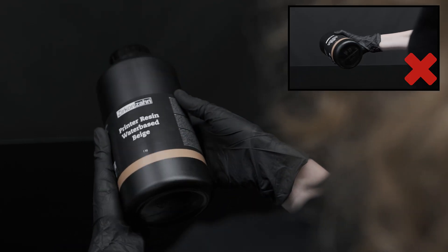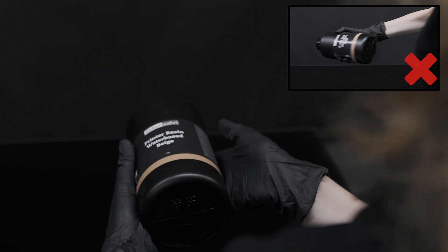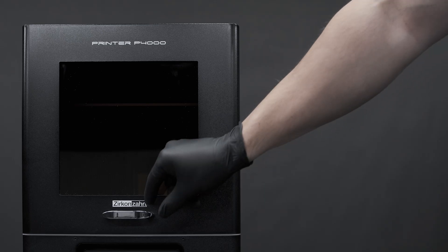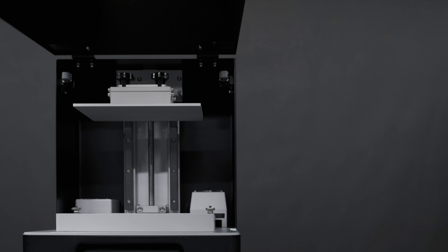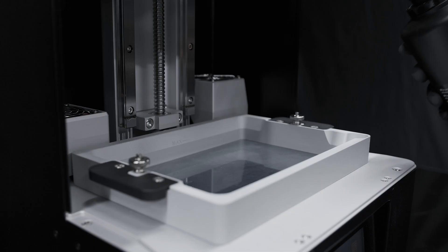Shape gently the resin bottle for about 30 seconds to make sure pigments are mixed homogeneously and to avoid air bubbles. After that, open the printer chamber and fill the vat with the required liquid resin, paying attention to the maximum level mark.